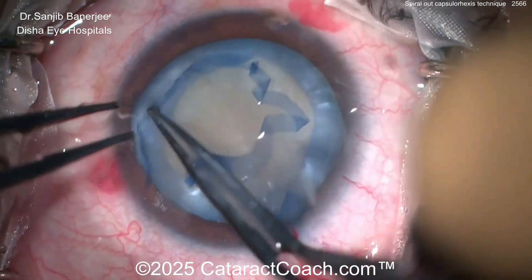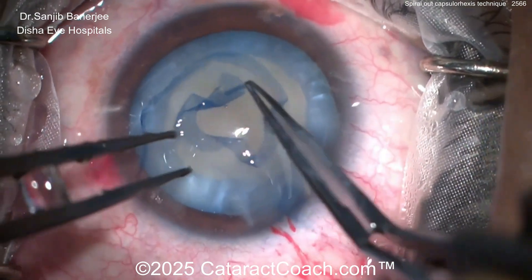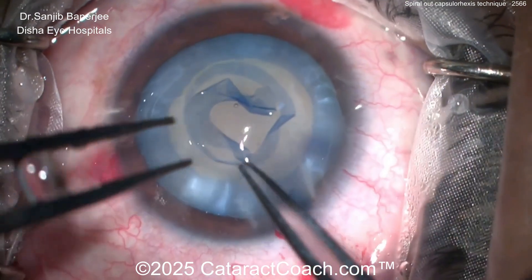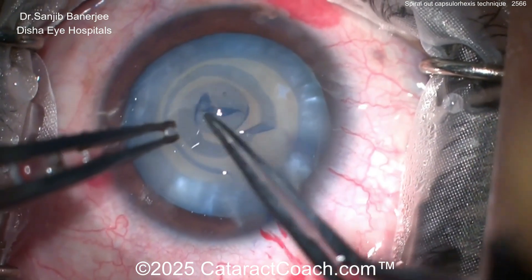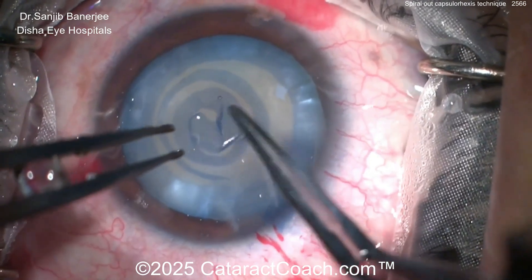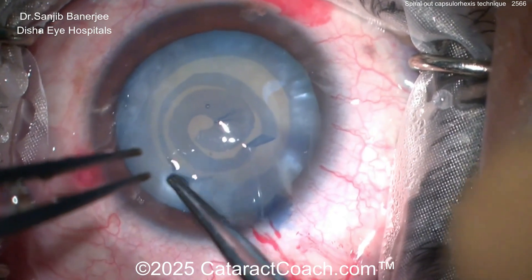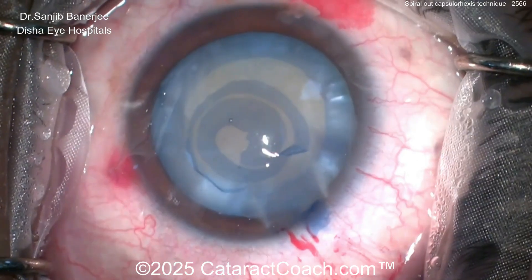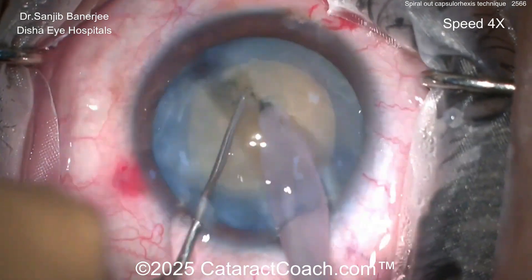It certainly does take control. If you're a beginning resident just learning how to do cataract surgery, this is not a simple technique — you have to have incredible, precise control. Look at that — there's the whole spiral. How fantastic! Look at that, open that last flap up — come on, make it complete — pow, there it is. The spiral-out rhexis. What a cool idea.